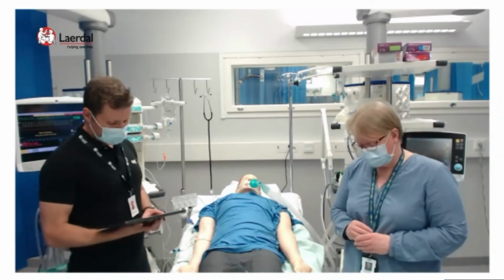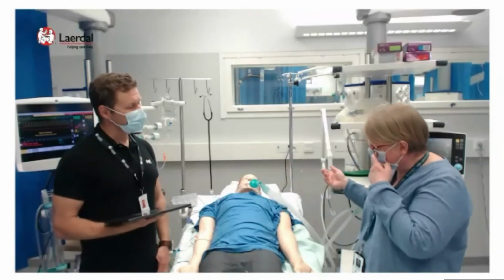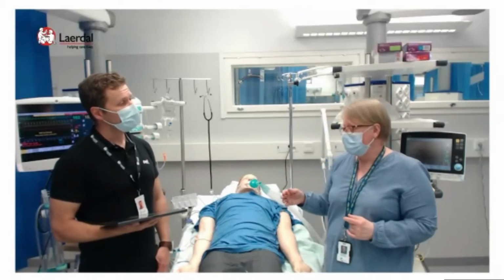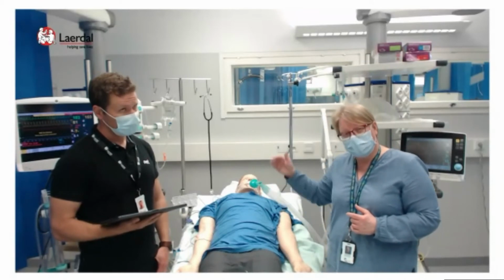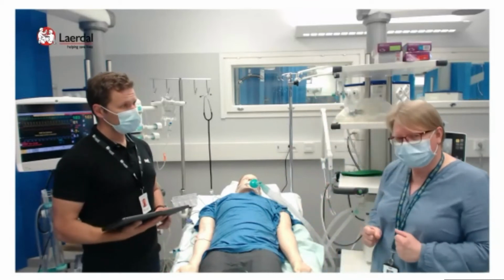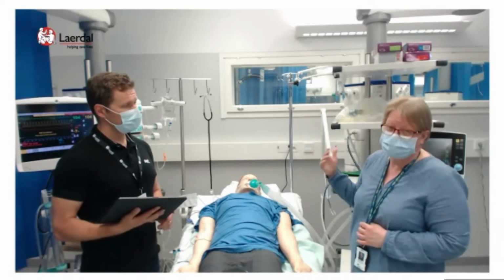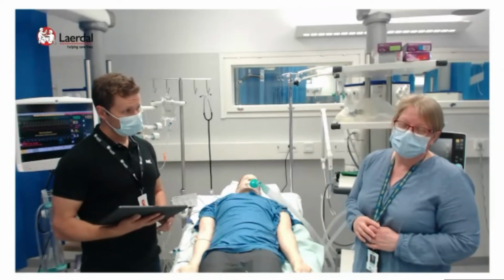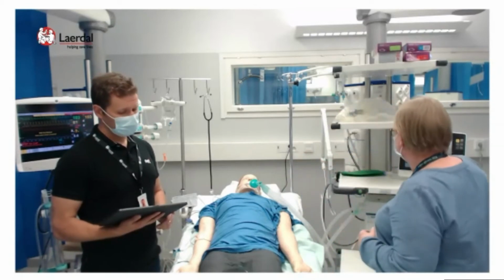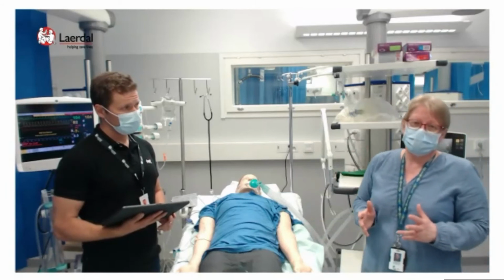Okay, any ideas? Not yet any ideas. So lots of thinking going on behind the camera. Well, go ahead. Well, at least if we haven't been giving a muscle relaxant like rocuronium, which we use, you can use others of course, I would give it right now because we have a problem with the high peak pressure. We should relax the patient so he doesn't resist the ventilation, and I would change the ventilation mode to pressure regulated volume control. It is important for participants who are nurses and doctors in the ICU to understand the difference between these ventilation modes. It is very important that volume control delivers volume.